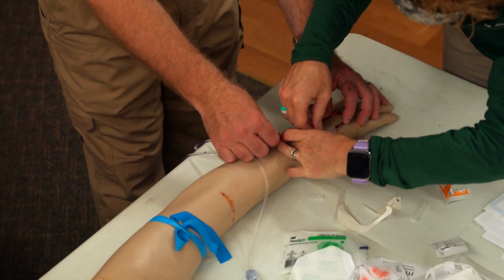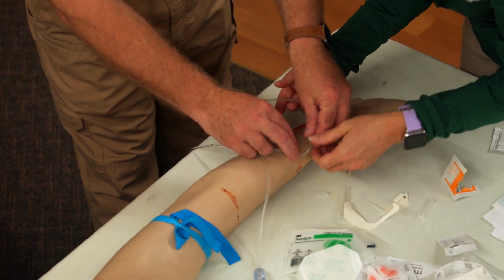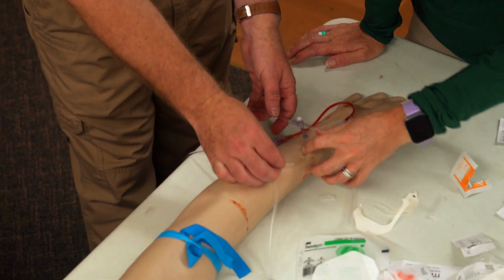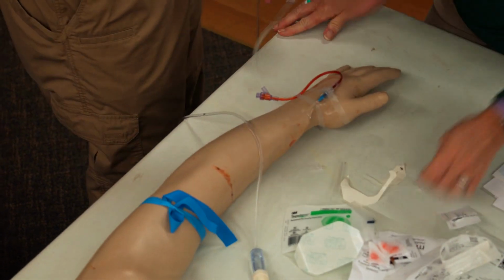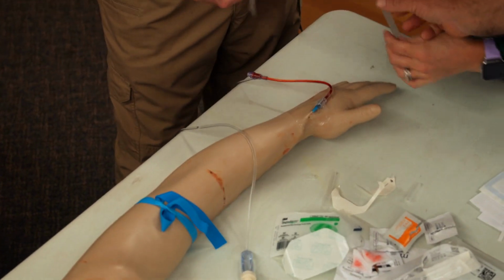Right, okay, I'll see you tomorrow, because then you came back. And then a lot of times I'll go farther up somewhere and come across here. Yep. Because that gives me just one more. So if I yank the tubing, it's just one more pigtail breakaway, so I'm not yanking this straight out. Okay, so, this is fun. So I'll see them when they wrap the tape.